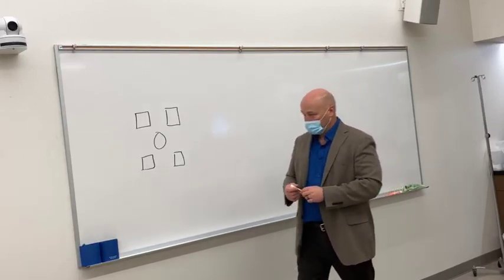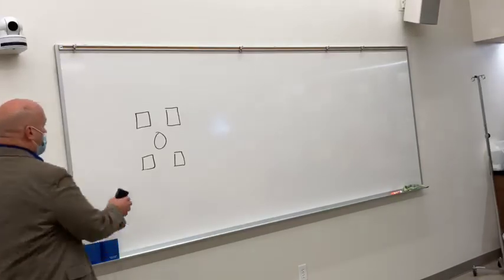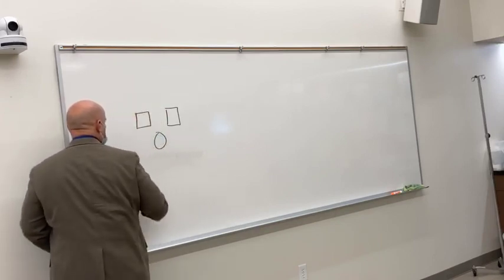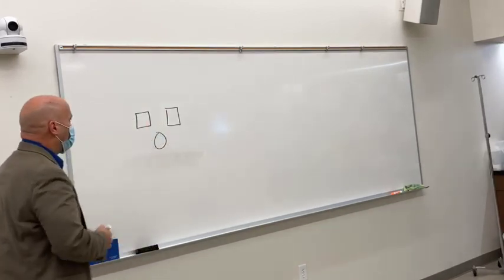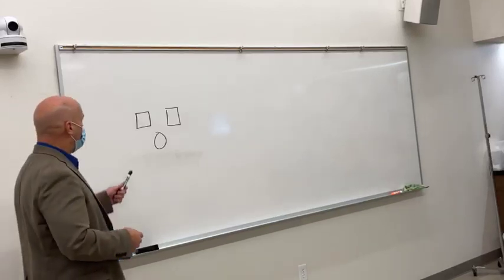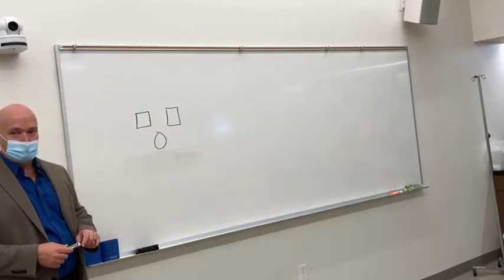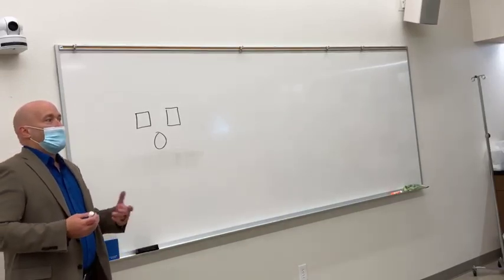So your phototimers are just radiation detectors, and when you make an exposure, you set up your tube, your system, and let's say you push the button that says chest X-ray. Well, what do you want to see on chest X-ray? It's lungs. Primarily, you're looking at lungs, right? So if we just limit this down to 2 or to 3, and we're most interested in seeing lungs, which ones of these would most represent where your lungs would be on the image? The top two, right.